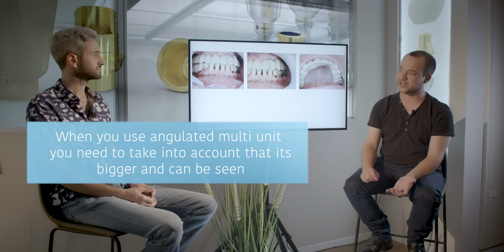But in this case, she has enough gingiva, and it's much better not to have a screw channel go from right here. So we used an angulated multi-unit. We saw in her smile that you don't see this metal, and from an aesthetic point of view, it's a good result because you don't see anything. She liked it. Amazing. All in all, for the bridge, the occlusion you need to correct a little bit, but you have great occlusion from the start.